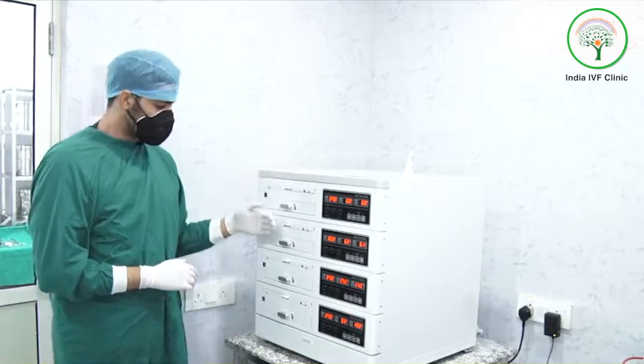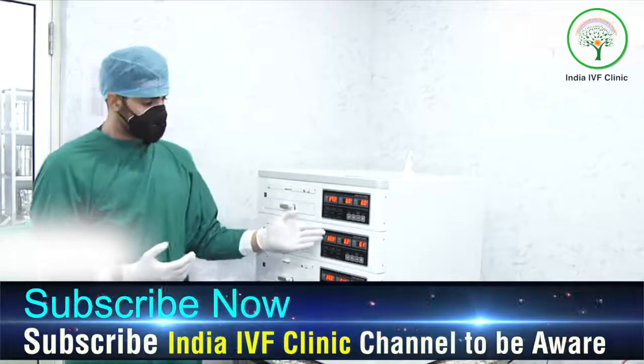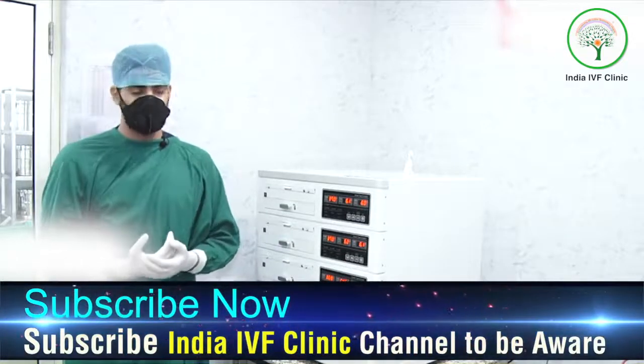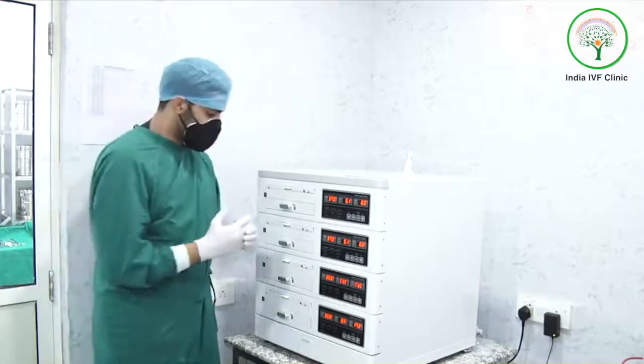We call it a cube because it has four different boxes and can act as four different incubators. This is the temperature gauge, which maintains the same temperature as present in the mother's womb, and the gases CO2 and O2 provide the same environment as provided by a human body.